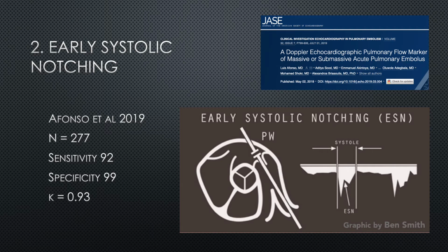However, they only looked at patients with massive or submassive PE, and they excluded patients with chronic pulmonary hypertension. Also, the scan was performed by relative experts in echo, so there's quite a few caveats to this study, and I don't think this is something that should be a routine part of our assessment of patients with PE. It's more just something to mention that may become more widespread in the future.